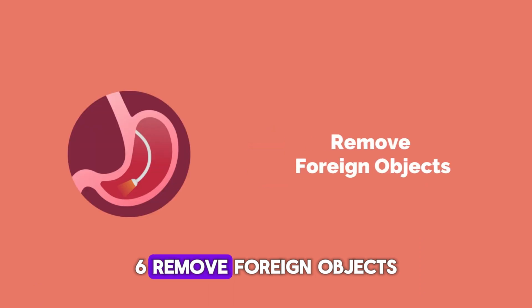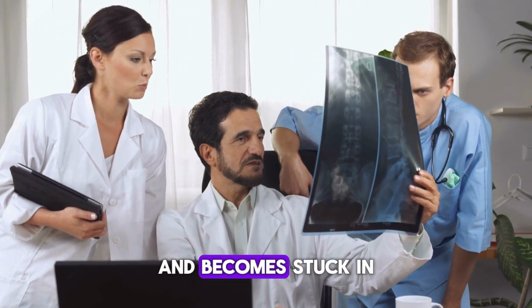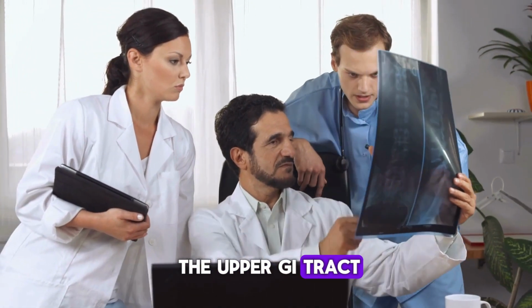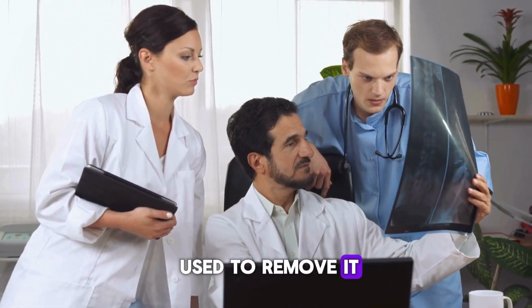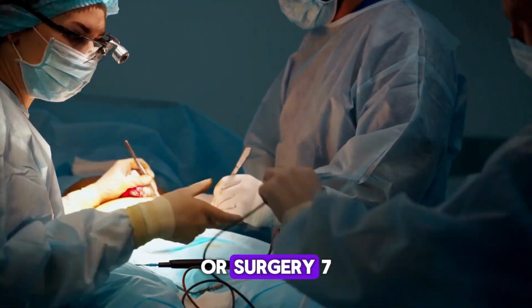6. Remove foreign objects. If a foreign object is accidentally swallowed and becomes stuck in the upper GI tract, a gastroscopy can be used to remove it. This avoids the need for more invasive procedures or surgery.